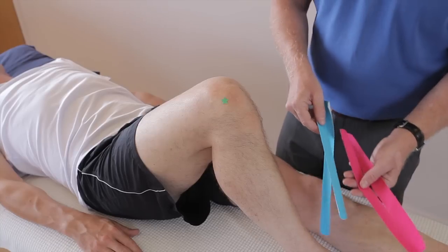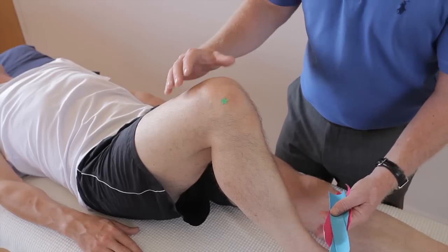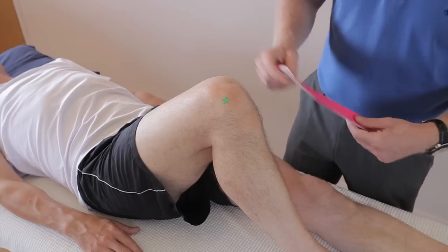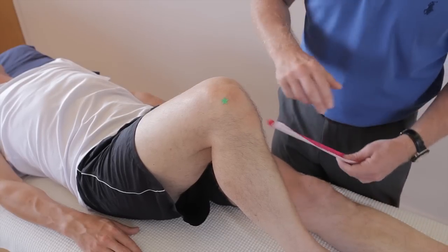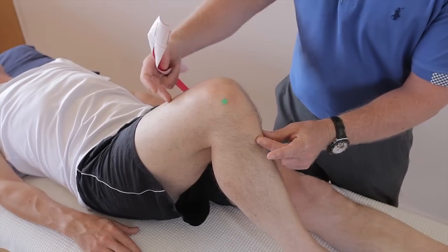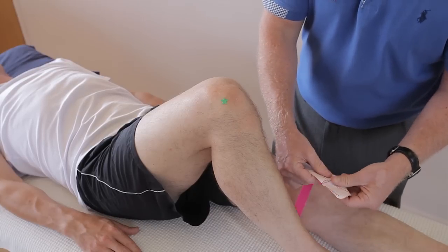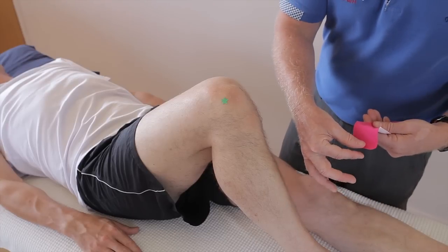I've prepared two eye strips formed into a Y. The knee is in flexion, so we put the tissue into a stretch position. The first strip goes from the superior aspect towards the inferior, and the second one starts on the inferior and finishes on the superior aspect. Turn it over, split the two legs, and apply the pad around.